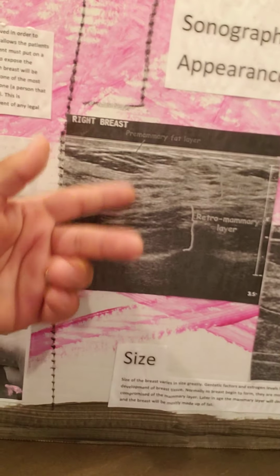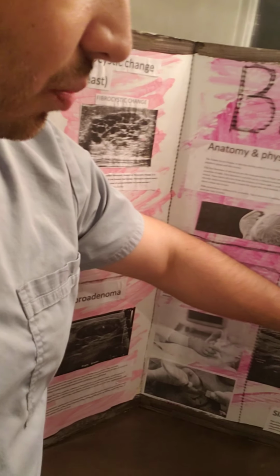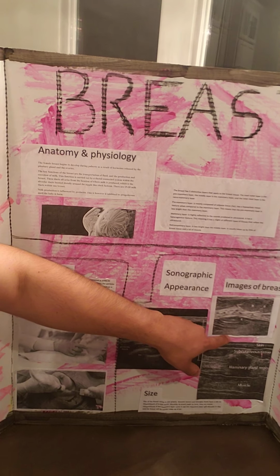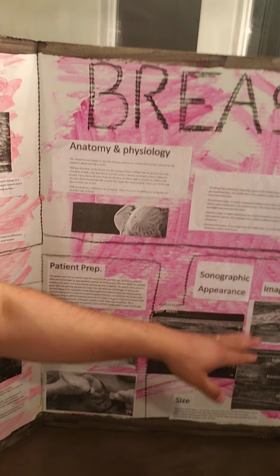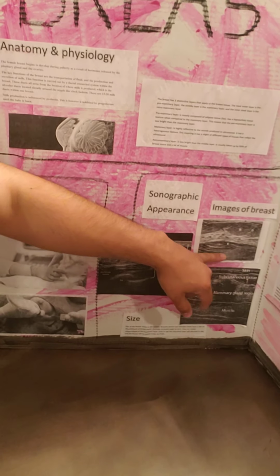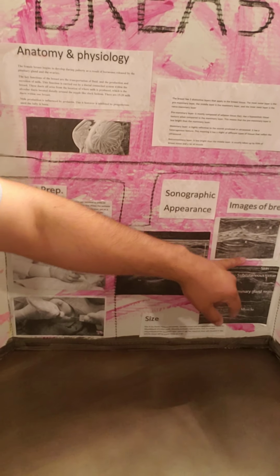These three images that I'm showing you go from the top to the bottom of the screen. So this would be the top of the screen, and this would be towards the bottom of the screen, meaning that this is more anterior and this is more posterior, towards the back, closer to the ribs than the other layers. So remember, this is the superficial layer, which is the outermost layer, and it goes all the way down deep into the bottom layer close to the ribs.